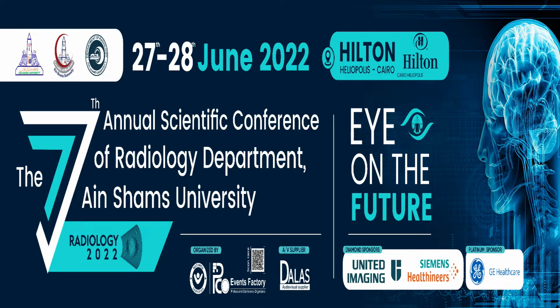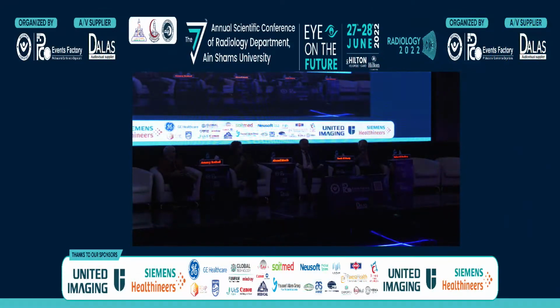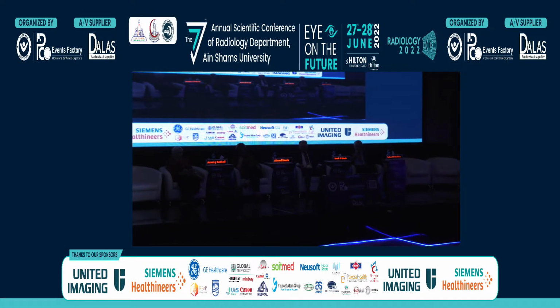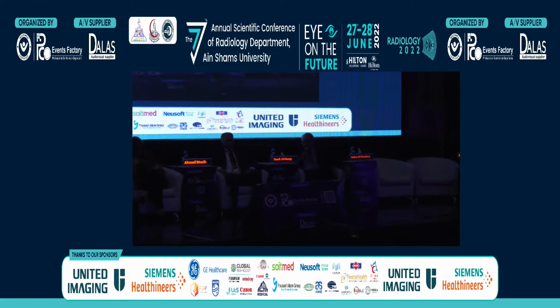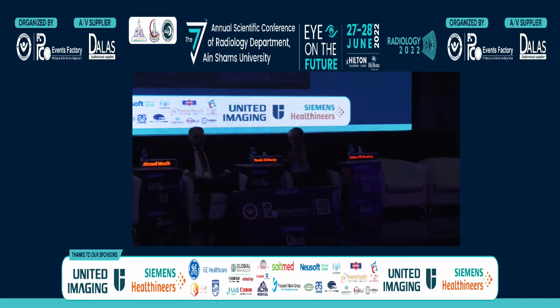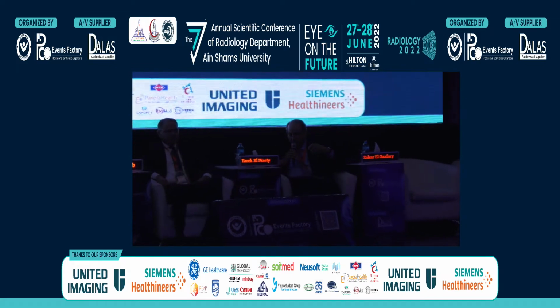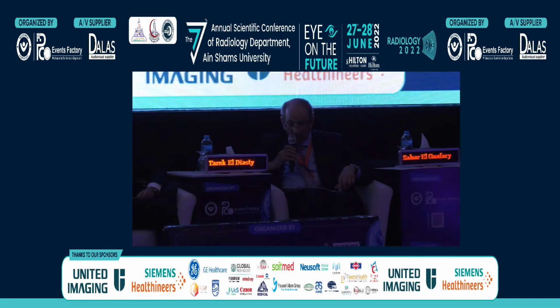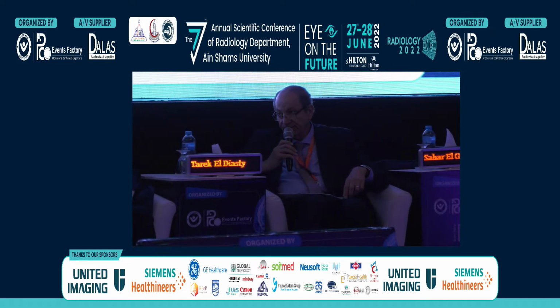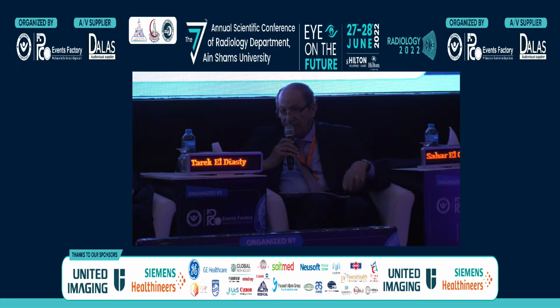شكرا دكتورة رشا. Thank you so much. I have a question regarding the dynamic contrast enhanced study. I noticed that in many cases there is only diffusion and T2 weighted image. Do you recommend to reserve the dynamic for indeterminate VI-RADS on diffusion and T2, or must it be done for all cases?